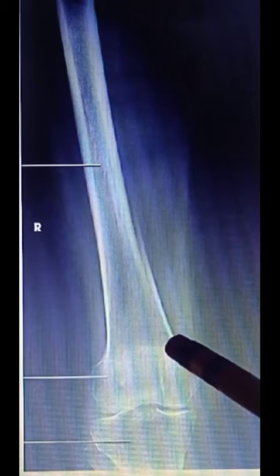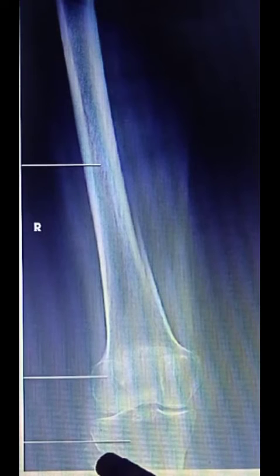So, no rotation is evident because the femoral and tibial condyles should appear symmetric in size and shape. So, the femoral condyles appear symmetric, and the approximate medial half of fibular head should be superimposed by the tibia. So here it was superimposed by the tibia. Then the femur should be centered to collimation field and aligned with long axis of the IR with knee joint space a minimum of 1 inch. So no motion occurred because there's a fine trabecular markings on the image, and it appeared clear and sharp throughout the length of the femur.